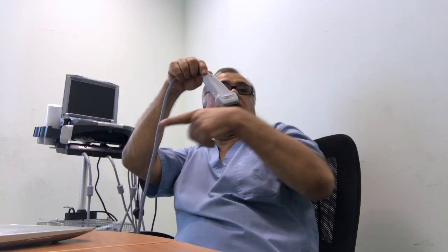Insert the needle through the skin on the lateral side of the probe at an angle of 30 minimum. I put a question mark on this presentation because I'm using 180. I'm going parallel to the probe, so it's easy to visualize. You can see the tip of the needle and all of the needle at one time. Pass the needle in the lateral to medial direction, from above to down, approximately 60 degrees. Needle reinsertion may be required. It is required. There are 3 techniques, so it varies in every technique.